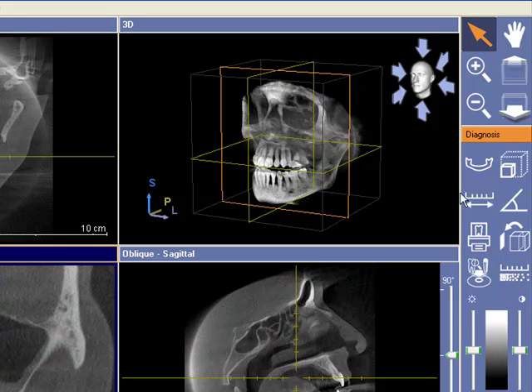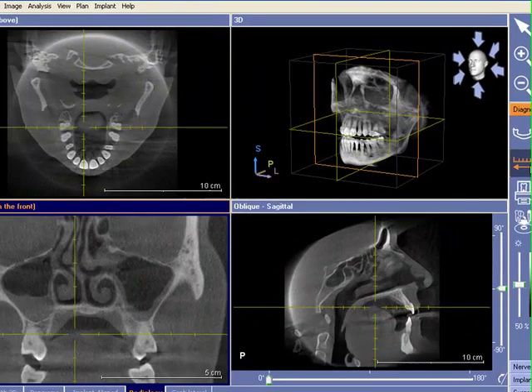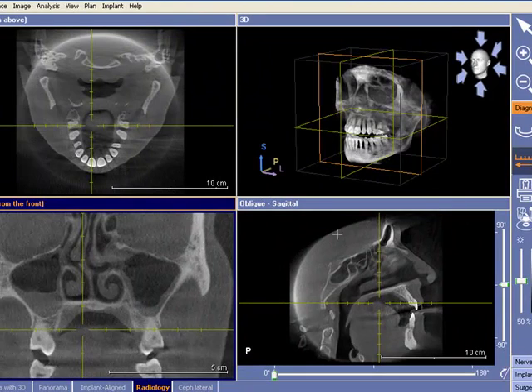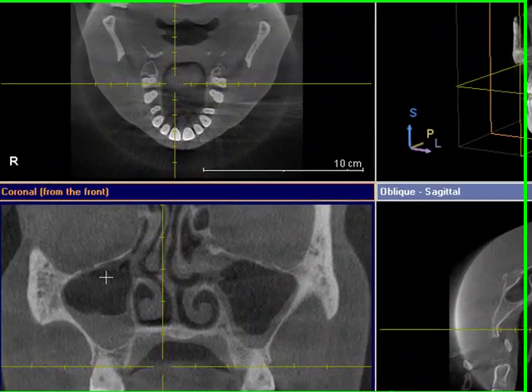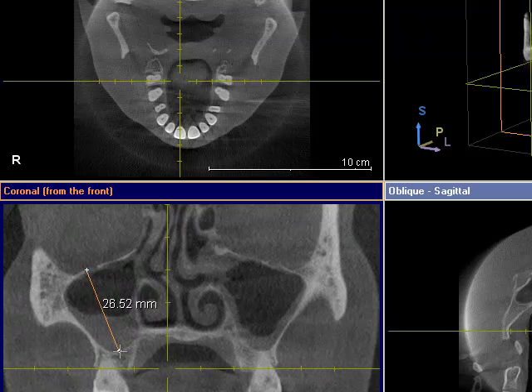Then you'll need to click on this measuring bar here called measuring distance. The key here is to left mouse click once and let go, and click again to finish your measurement.